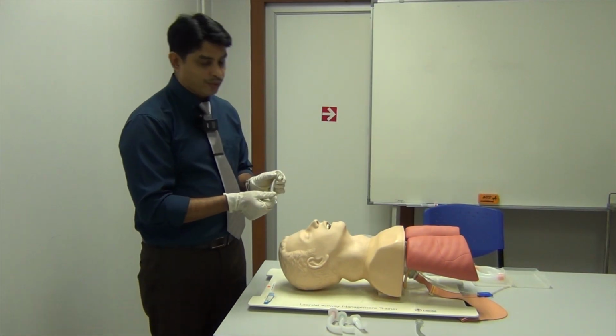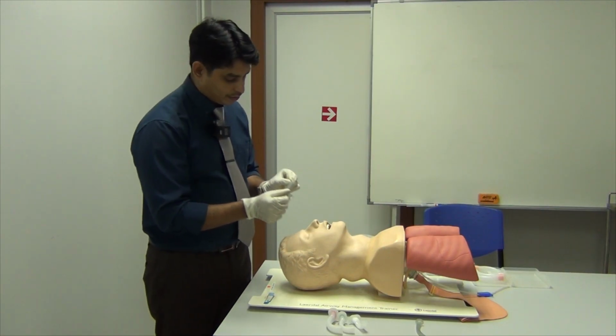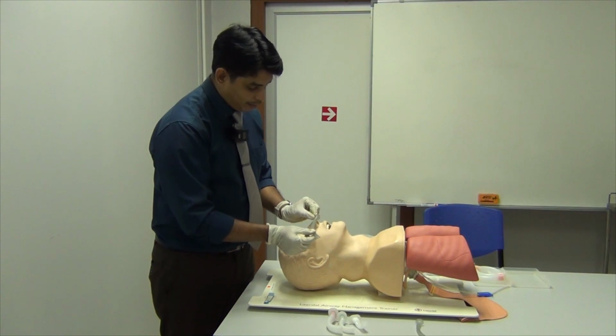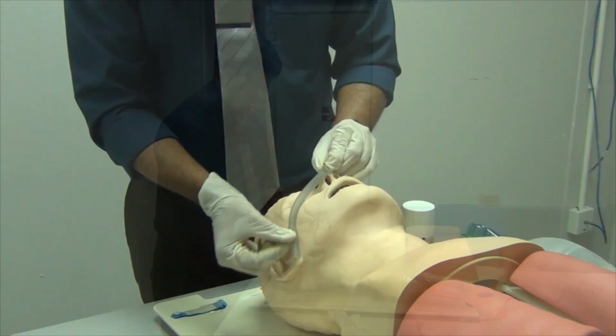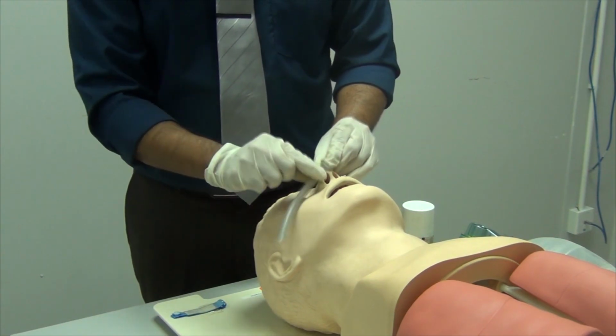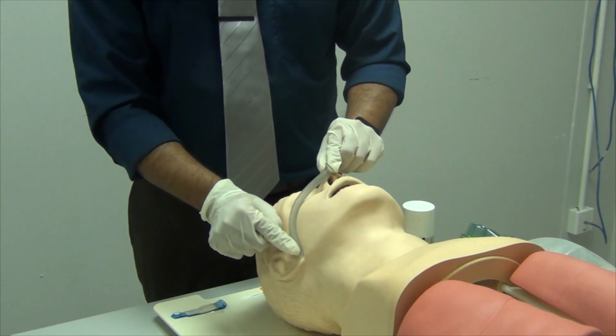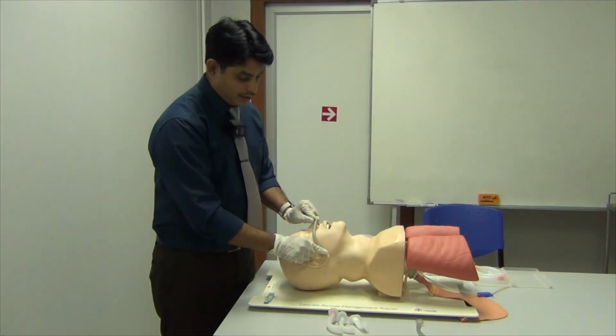So next is how to size this NPA, the nasopharyngeal airway. The correct measurement is from the tip of the nose to the ear lobule. So this is the right measurement. You take the measurement from the tip of the nose to the ear lobule, right?